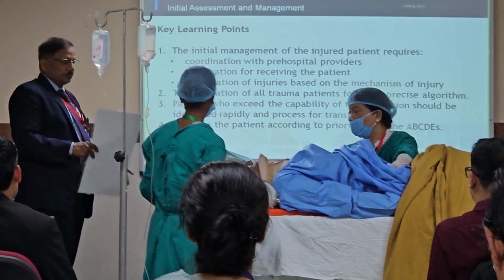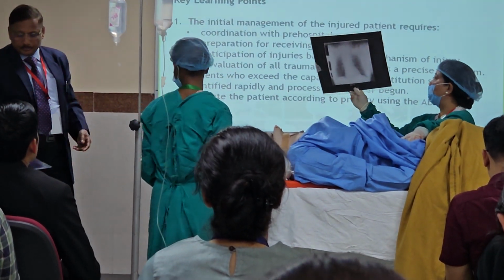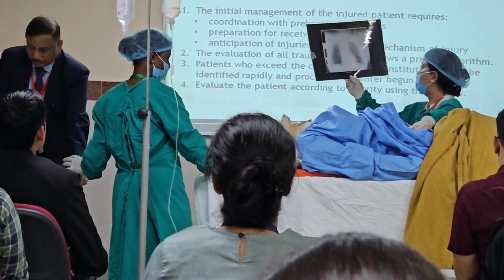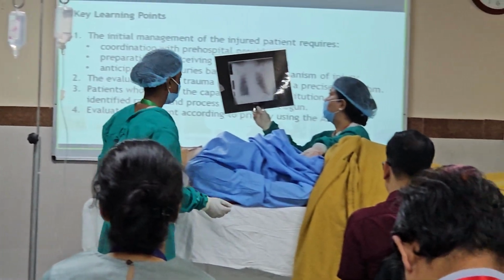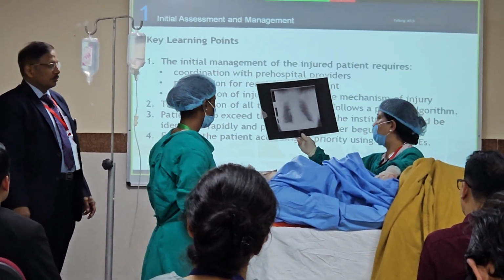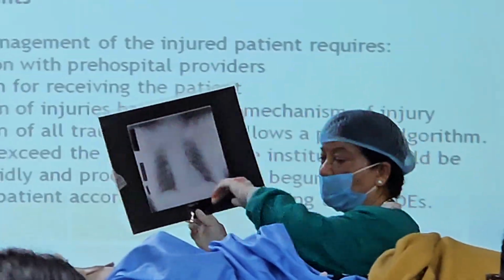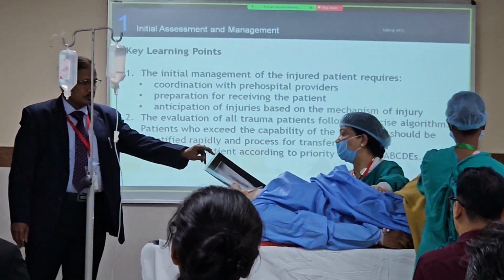And now I will go ahead to the chest X-ray. Oh, so I think in the chest X-ray what I can see is an enlarged mediastinum, a widened mediastinum. Otherwise the lungs are clear. And I think my tube is in the right position as per this X-ray. So I anticipate, sir, that the widened mediastinum with the bruises on the chest might convey to me something which might need a referral outside.